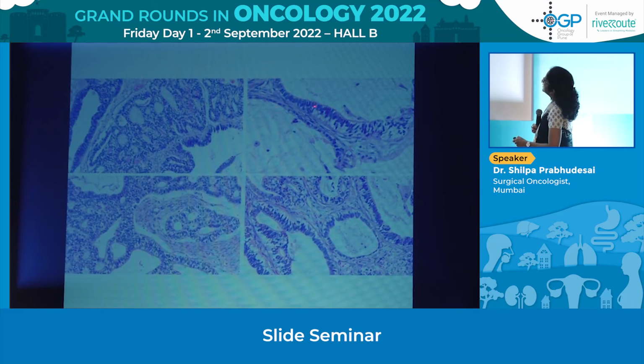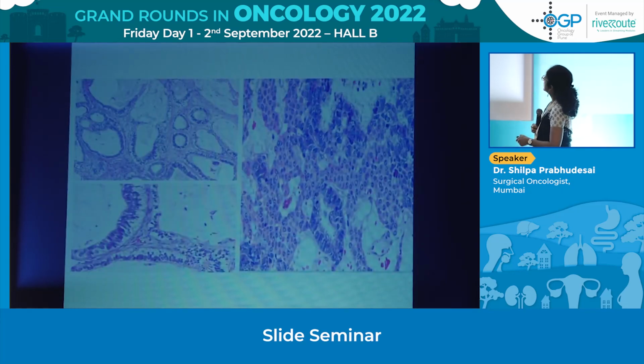Some more images, and here is that look of subnuclear vacuolation, which suggests an endometrium kind of appearance, with some cribriform areas. We did not find any teratomatous components. This is again subnuclear vacuolation. There were a lot of areas of necrosis, and this case came for a second opinion, and to give the pathologist credit, she had taken almost 45 sections of a 20 centimeter tumor. But this is how the viable areas looked.